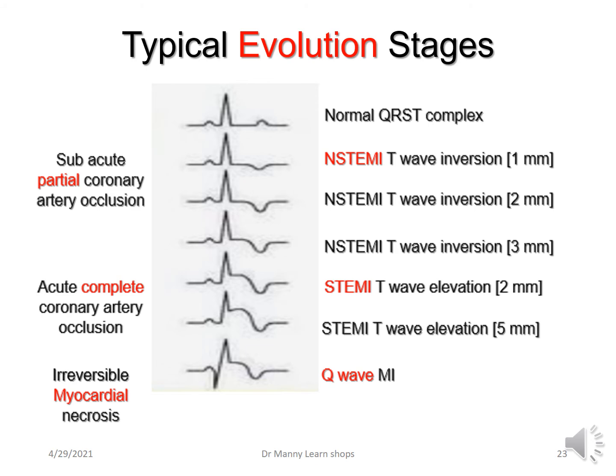Depends on the picture. When you've got complete coronary occlusion, this results in STEMI, which is ST segment elevation myocardial infarction, which can be more than 1 millimetre, 2, 3, 4, 5, 6, 7 millimetres above the isoelectric line. And this also has T-wave inversion.